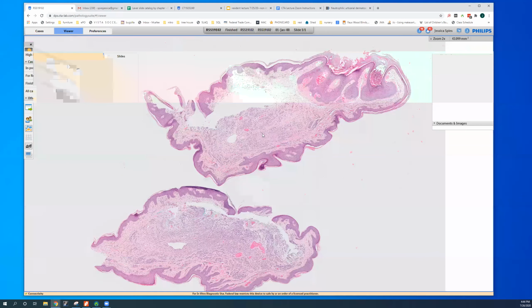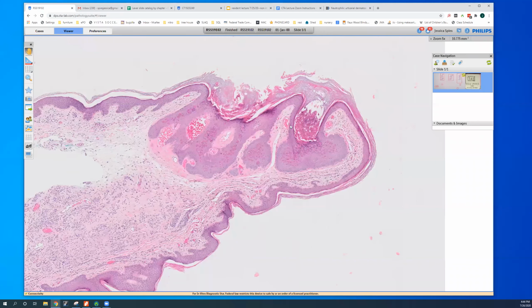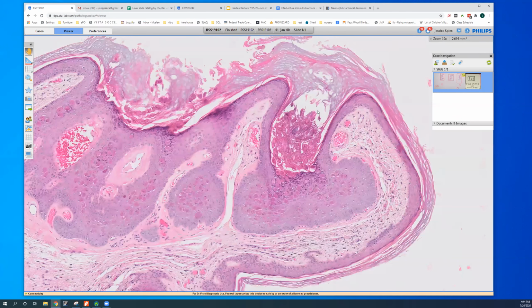This is similar but different. Let's look at the surface here first. Anybody want to hazard a guess? I've got these almost verrucous projections. Yes, molluscum. Fantastic. This is low power diagnosis. It looks like a verruca almost with this kind of cup-shaped architecture.